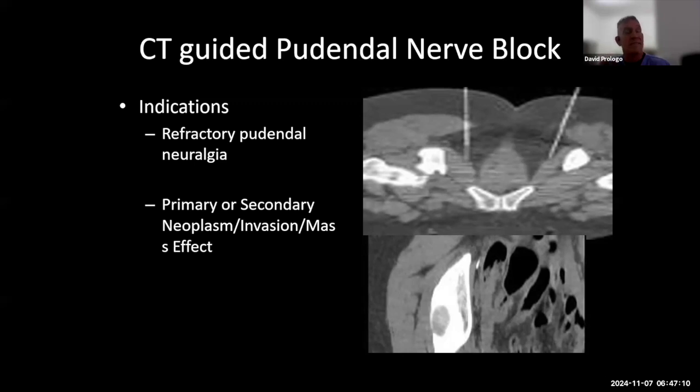But for illustrative sake, if you had no cancer and pain that was outside of the spine, that's going to drop you into that bottom left box, right? Essentially, that's the whole body outside of the spine, not related to cancer, and that's going to be nerve targets for us. With our cross-sectional imaging and our techniques, we can reach just about every nerve or plexus that you can conceive of. And if that nerve is carrying pain or is damaged in and of itself, as is often the case for pudendal nerves, then we can reach those nerves using cross-sectional imaging, and we can interrupt them or inject them.